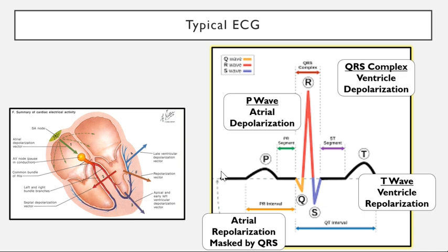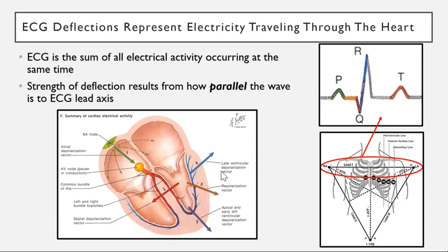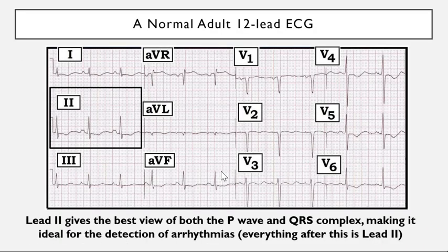We're going to be going over what the graphs look like and what they mean today. So you delete the Lead 2, the vector stuff, you can delete these 2 slides. Another 3 vectors: precordial chest leads, V1 through V6. So it's just other ways of measuring electrical conductance.